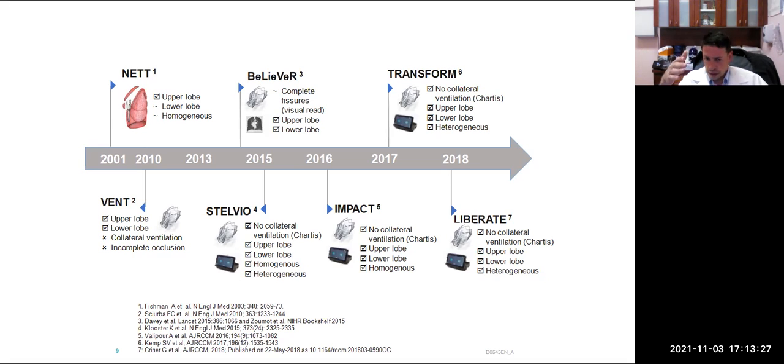And then in contrast, you see that there's been a number of valve studies. Now, this slide is from the Pulmonx company. That's the company that made the Zephyr valve, so that is why all of these are Zephyr trials. There has been at least one major Spiration trial. That's the other valve, which is made by the Olympus company. So half a dozen at least of valve studies.